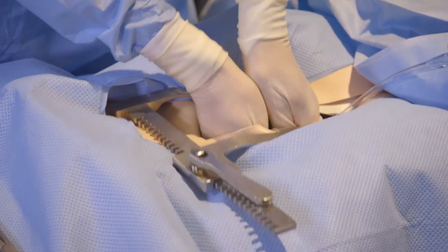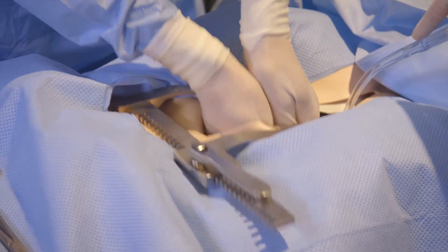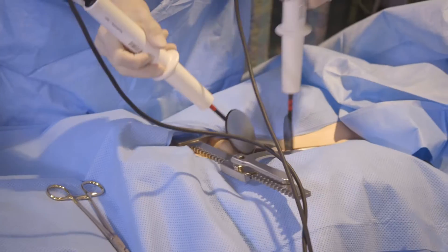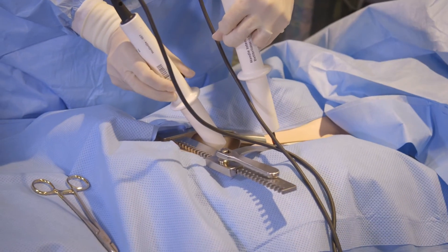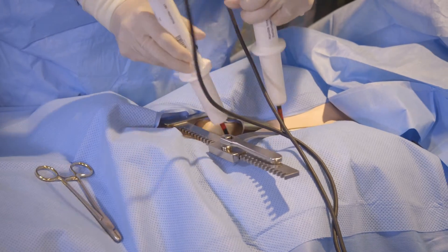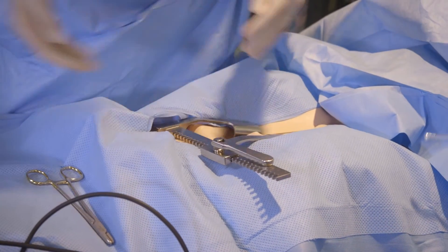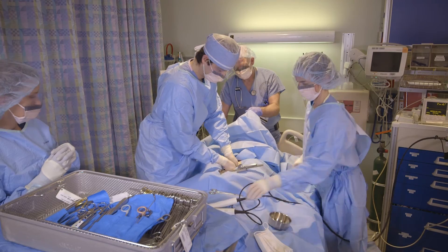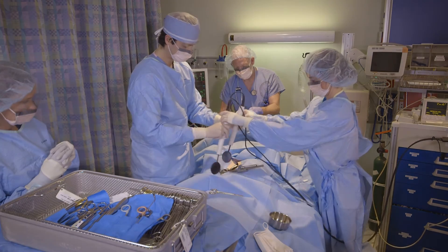The surgeon will then do cardiac massage for one minute. If the patient remains in VT or VF, we will use the internal defibrillation paddles, shocking at 20 joules. If there is no response, continue internal cardiac massage and prepare for another shock. Charging on 20.